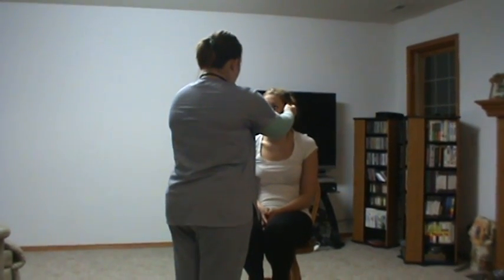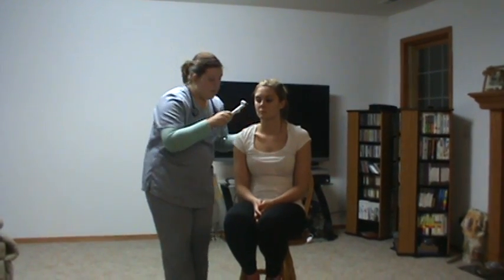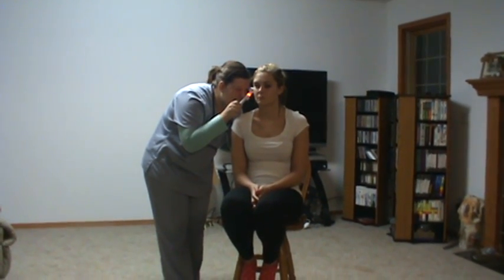Now I'm going to assess her ears. Her ears also seem to be symmetrical. They're both the same on her head. So I'm going to be looking into the ears to assess her eardrum. Okay, they are a nice pearl gray. Doesn't appear to be any inflammation or redness in the other. Same with this, pearl gray with no signs of irritation.